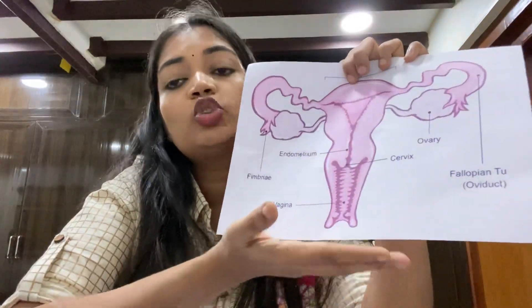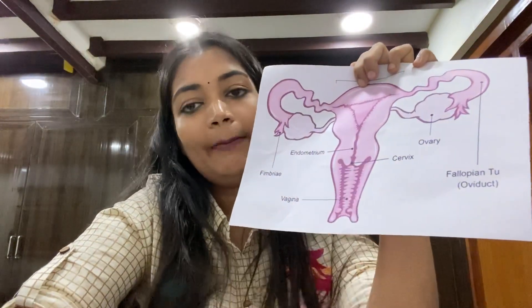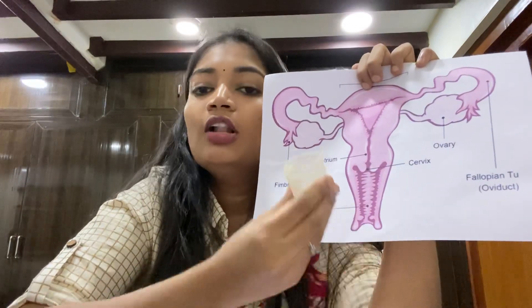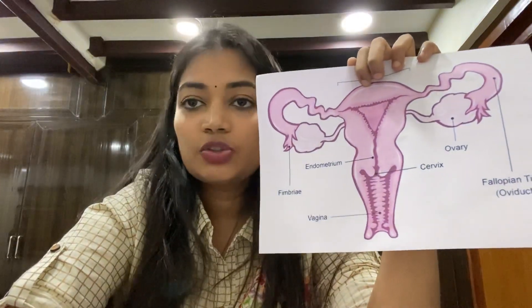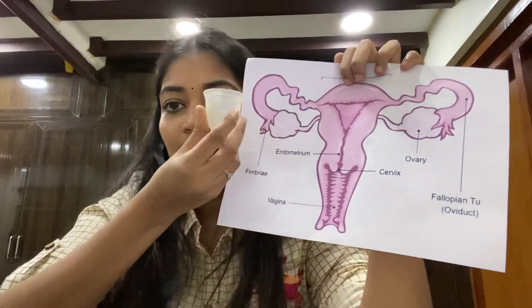Advantages of the menstrual cup: it is very comfortable, and you can do activities like dancing, workouts, and swimming. It is rash-free — unlike pads, which can cause rashes because the blood soaks into the pad material. Compared to tampons: tampons are cotton that absorb blood, can change the vaginal pH, and are associated with toxic shock syndrome. The menstrual cup, however, is made of medical-grade silicone material, making it safe to use.